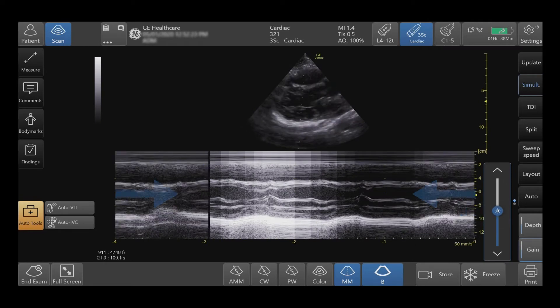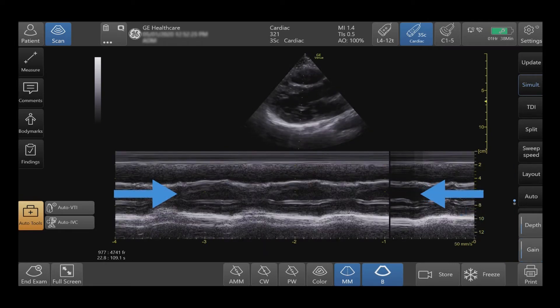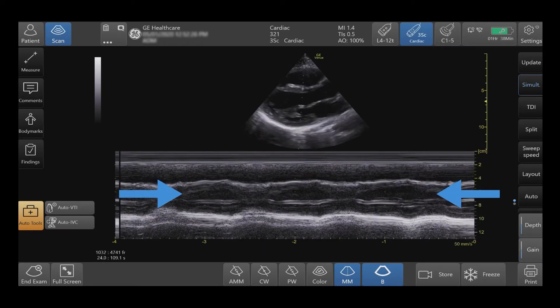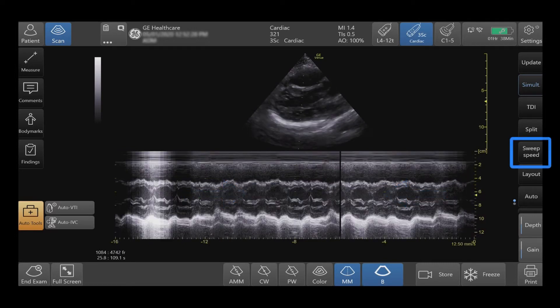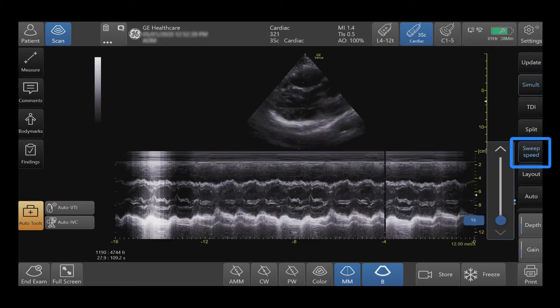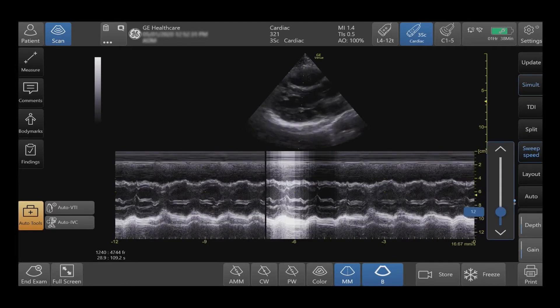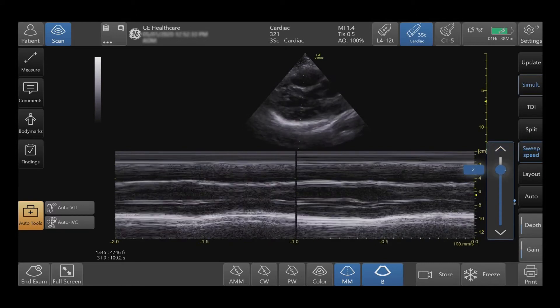To adjust Sweep Speed, pinch the waveform or tap Sweep Speed, then tap the arrows or drag the sidebar up or down.